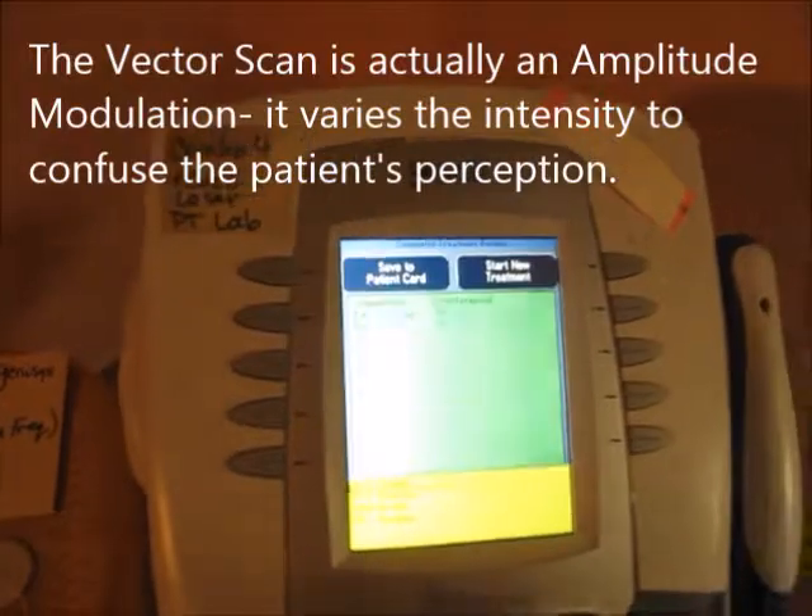I'm going to hit stop on that and start a new treatment. I'm not really adjusting the frequency settings much here because I want to talk about the pad placement.